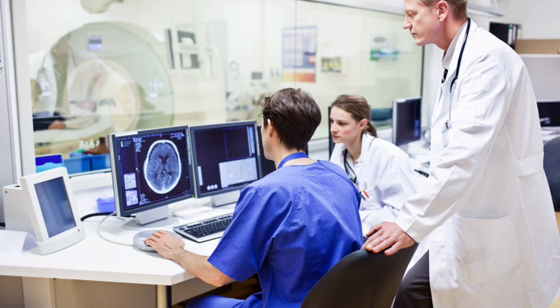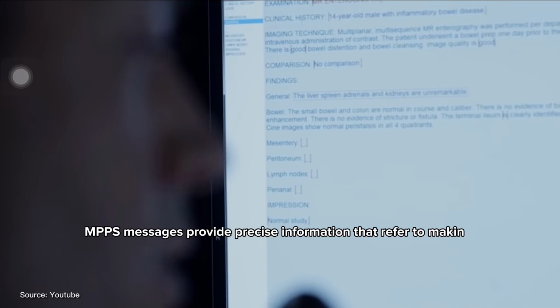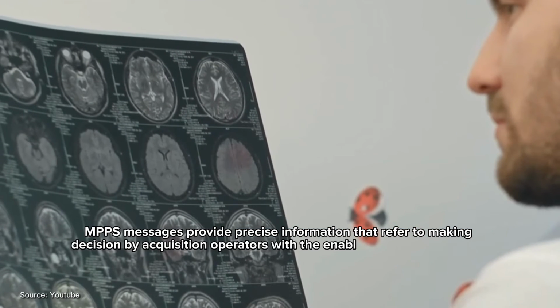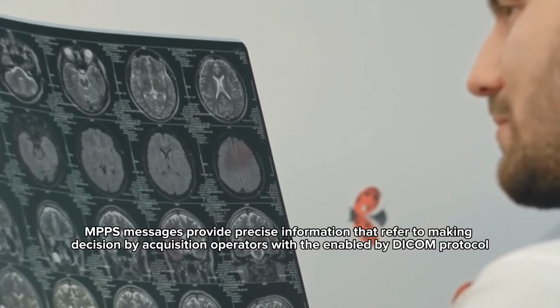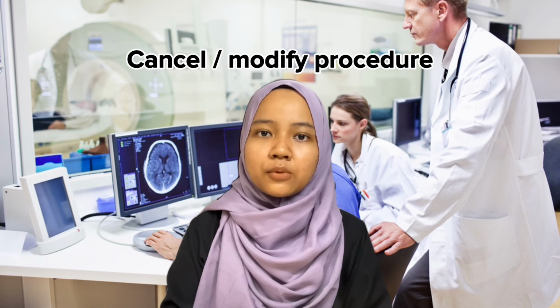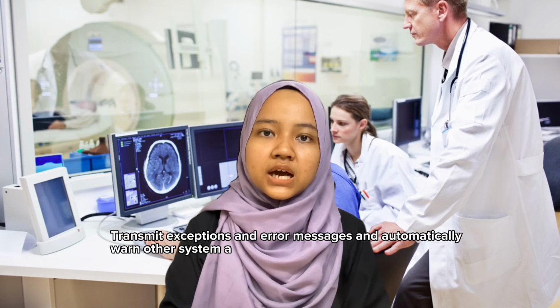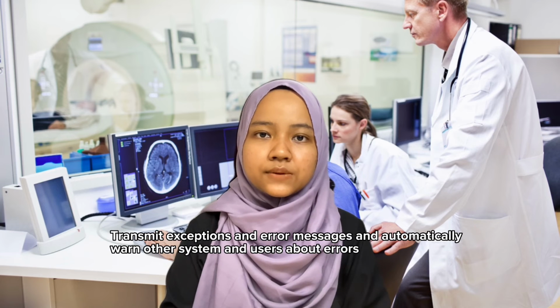Next, data accuracy. At the acquisition equipment endpoint, a single point of data entry permits data accuracy. MPPS messages provide precise information that refers to decisions made by the acquisition operators with the enabled Dicom protocol. An example of the MPPS messages is cancelling or modifying a procedure. Furthermore, MPPS messages also transmit exceptions and error messages and automatically warn other systems and users about the errors.